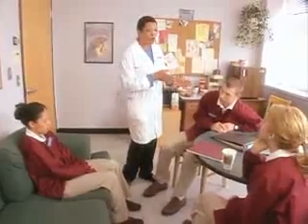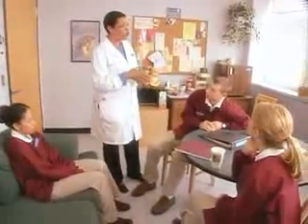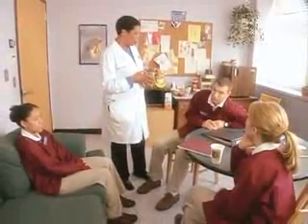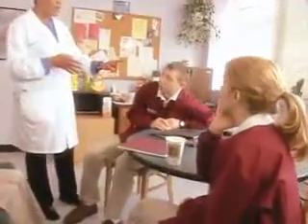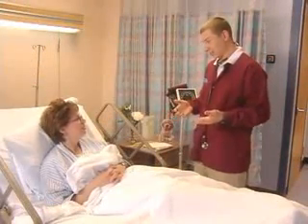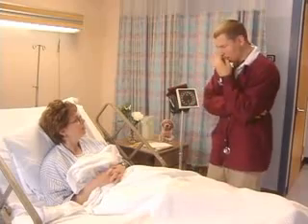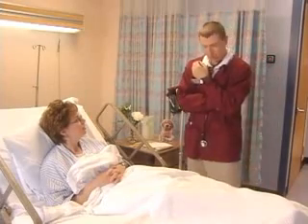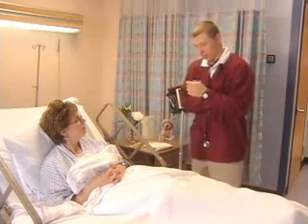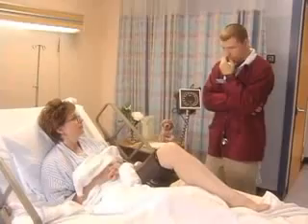Now, sometimes there are other situations you'll have to make special accommodations for. Earlier Mark worked with a patient who had a right modified radical mastectomy and had a PICC line in her antecubital fossa. Mark, how can you go about measuring her blood pressure? Well, you can't take her BP on her right arm because of the mastectomy. That's right, because there's an increased risk of lymphedema. And you shouldn't use her left arm because the PICC line is inserted there. Pressure from the cuff could damage the catheter or injure the surrounding tissue. And so what would be the best site? I guess the best blood pressure site would be her thigh.